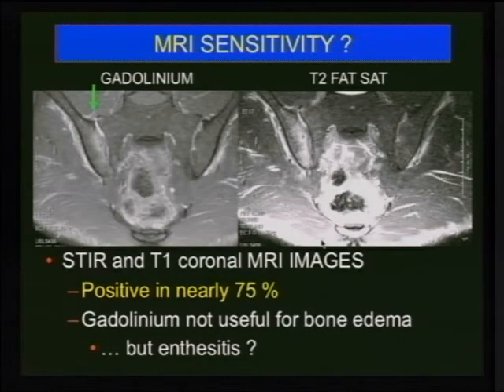The use of gadolinium is really sometimes helpful in some of the cases, especially if you are thinking about enthesitis, inflammatory response. So you can inject the contrast in these cases.